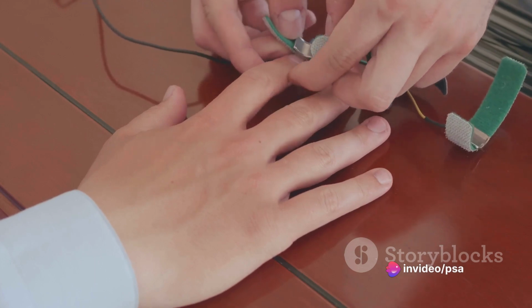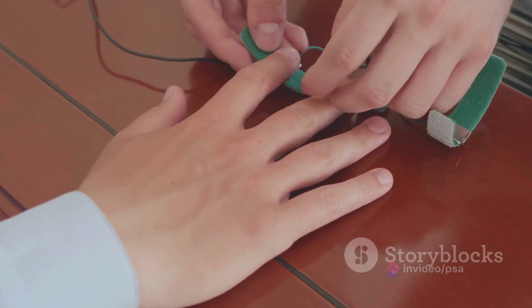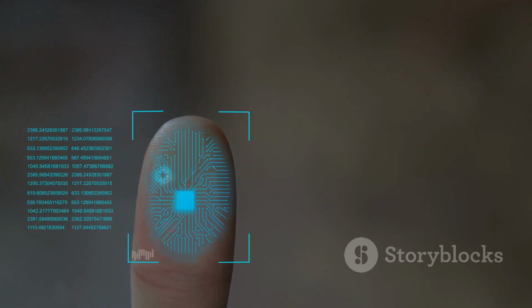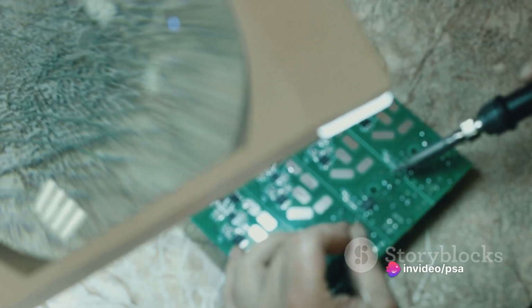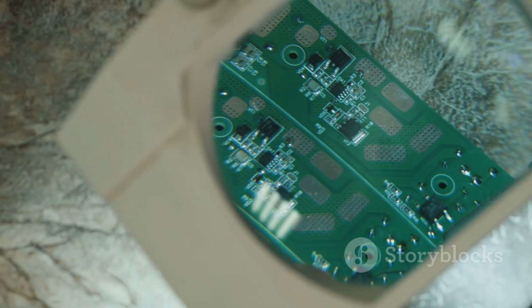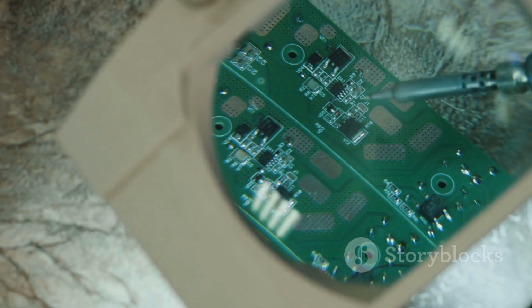These waves are transmitted to the brain, and voila, the brain perceives these signals as touch. But the story doesn't end there. The electronic skin is not just about sending signals to the brain, it's also about conserving energy. Unlike its predecessors, this prototype of electronic skin operates using significantly less energy. This means it stays cooler, making it more comfortable for prolonged use.